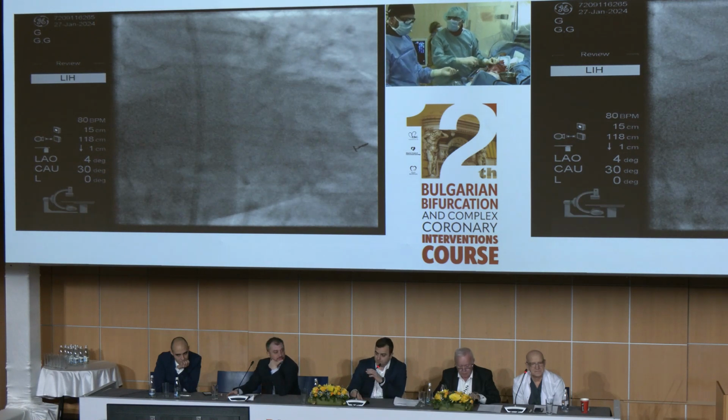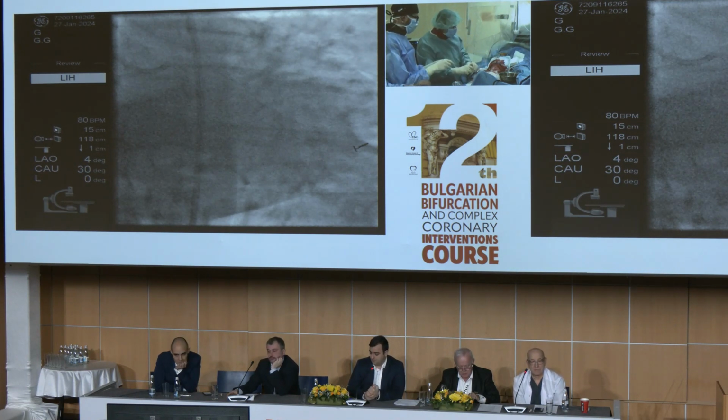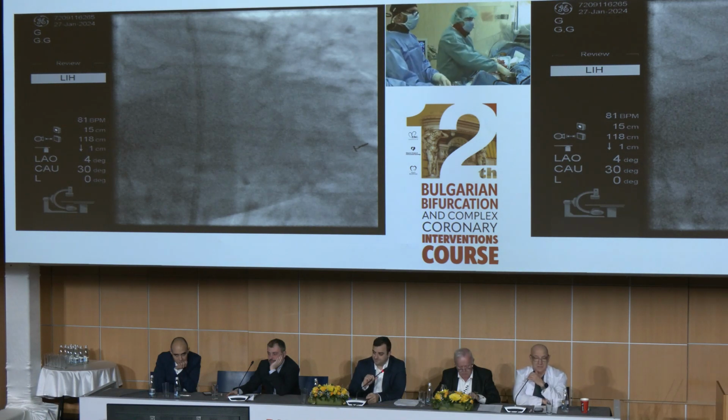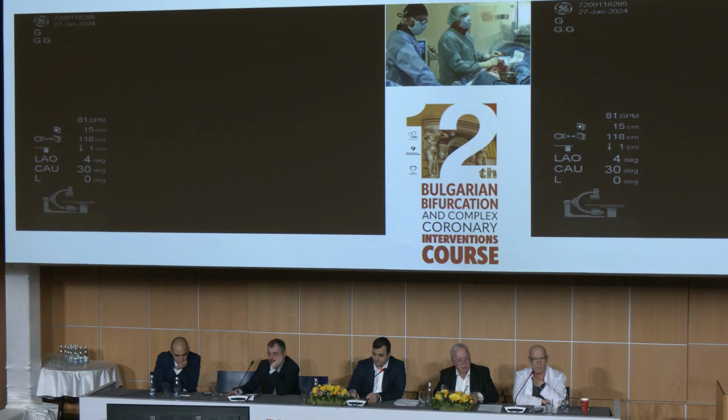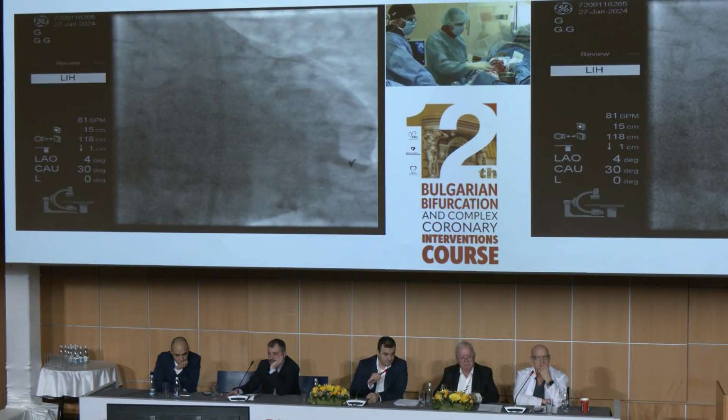The other point for discussion is to use DCB in such a long calcified lesion, well prepared. DCB, in my view, is a viable option for this situation. Absolutely, you are absolutely right.